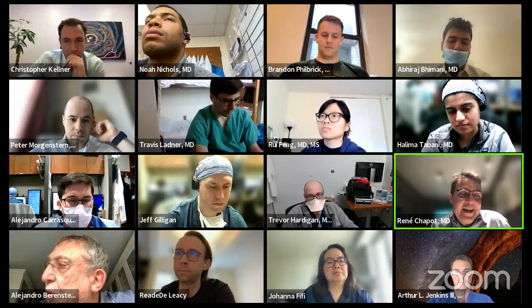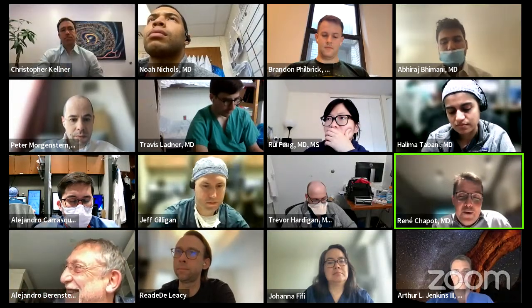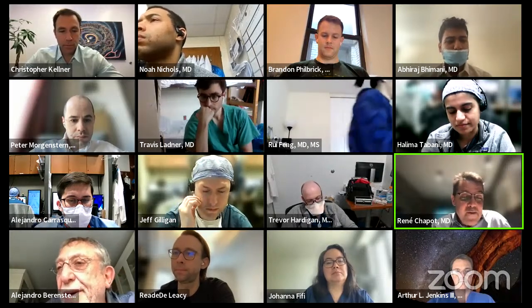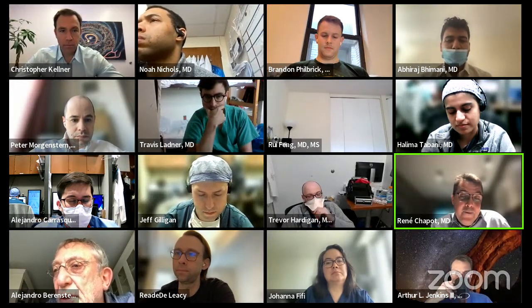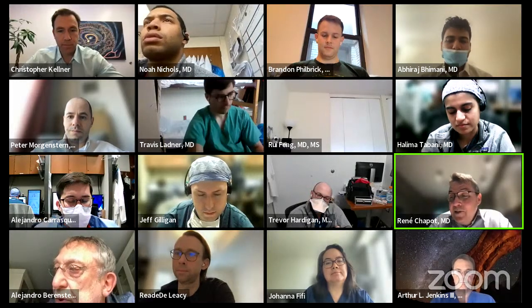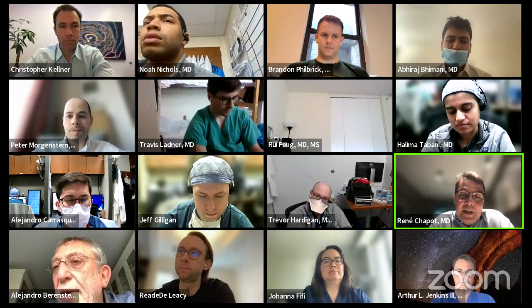But conversely, if this likelihood is higher, then at some point you have the risk of having some embolic agent reaching the arteries. That's why maybe you saw, but I did not want to go into these points. In some patients, especially the pericallosal ones, when we embolize through the veins, we preventively place a stent retriever in the arteries where all shunts come from, because if we continue, at some point we will reach the arteries. So all those factors have to be considered, and that's why it's great, it works, but I think that AVM treatment will and must remain in centers where this is being done often.